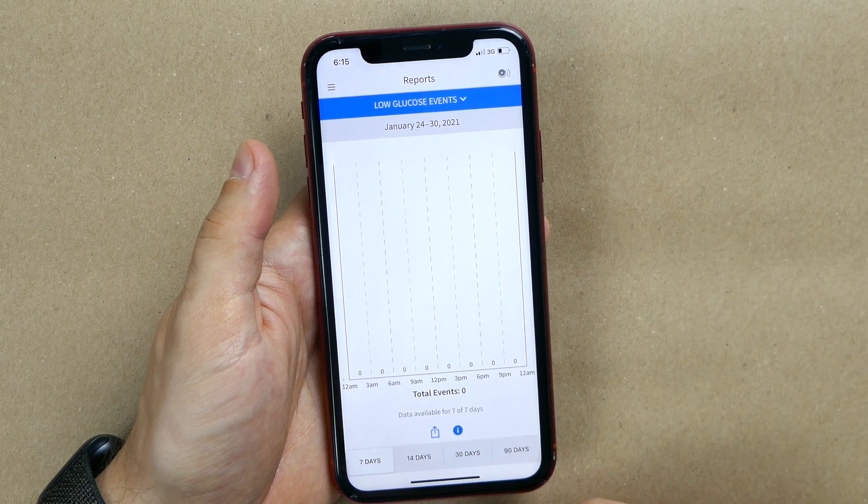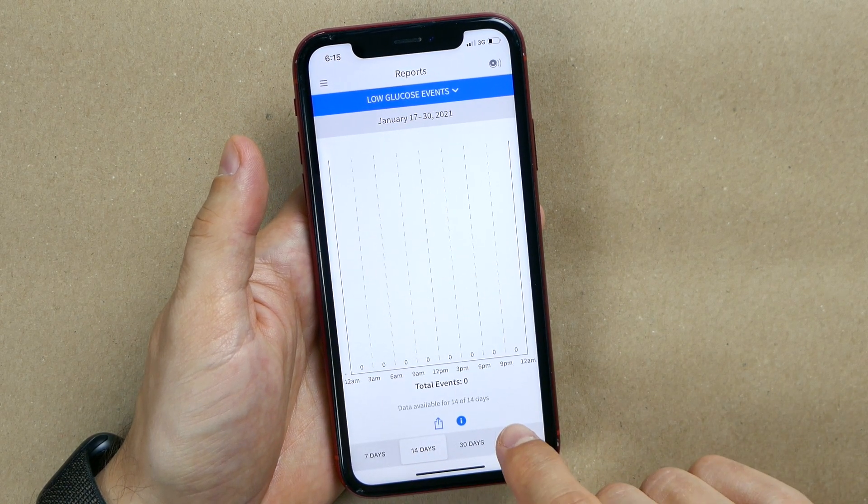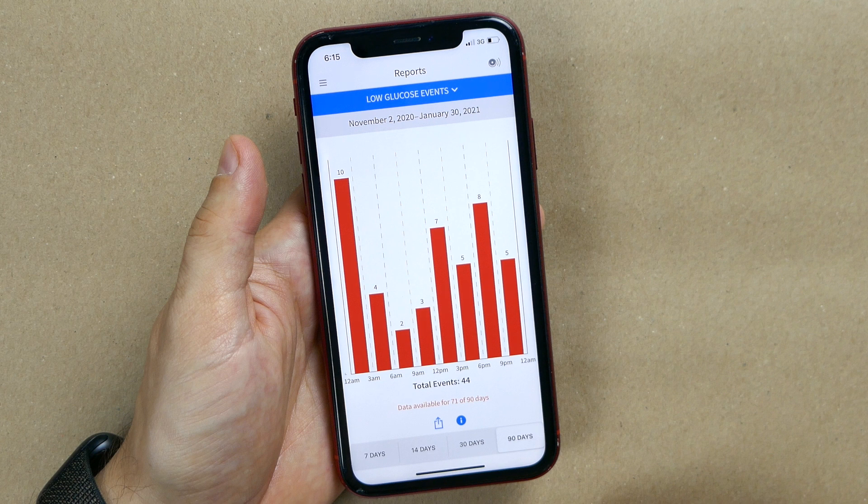Next is low glucose events, another very important indicator. My goal is to eliminate most if not all hypos. I look at this screen from time to time because it helps me find the times of day when my blood sugar drops most often. In the last 90 days I had 10 low glucose events between midnight and 3am when I'm usually sleeping — which can be really dangerous. This might tell you to reduce your insulin dosage or eat some extra carbs before bed. In my case these events were caused by a faulty sensor showing slightly lower readings than my actual blood sugar, so use this feature to identify and investigate your real patterns.